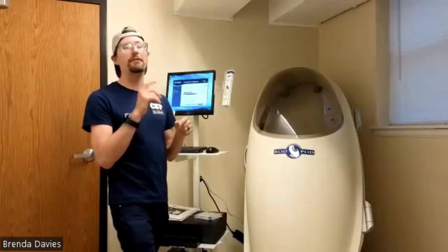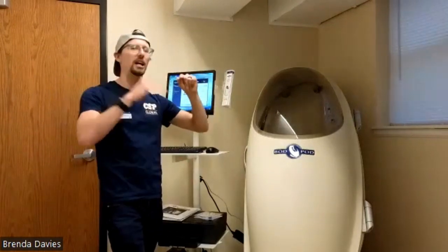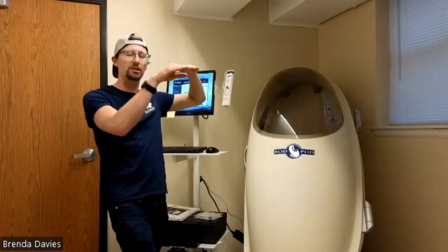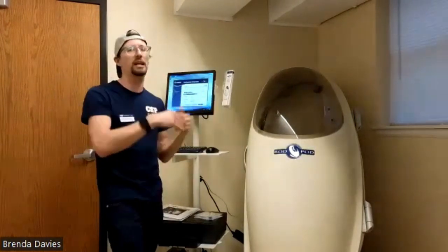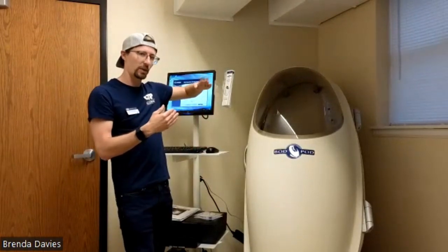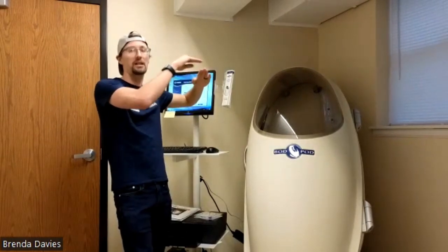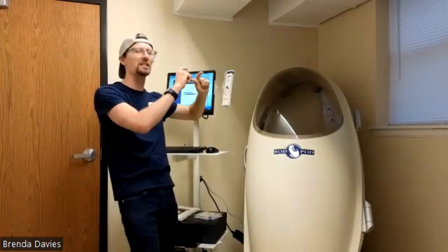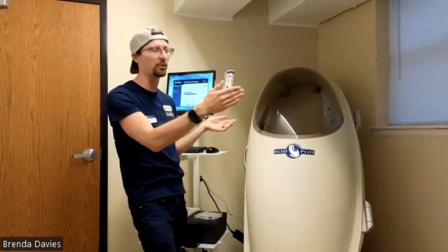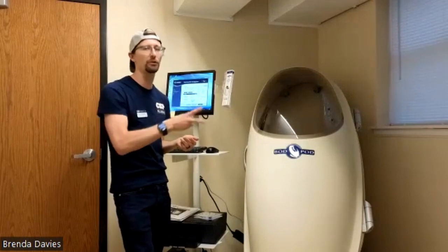Yeah. So if the first two tests for the Bod Pod aren't exactly right on, it'll ask you to do a third one just to make sure that there's a best fit line. You get a trend when you have three; you can only make a line when you have two. So if you look at it statistically, if there is a slight wiggle between the first and the second, but then the third one hits closer to the second or closer to the first, you can see, okay, there was a slight variation, but we can get a better value for that individual with the third point. Sometimes the Bod Pod just works perfectly and you only need two.